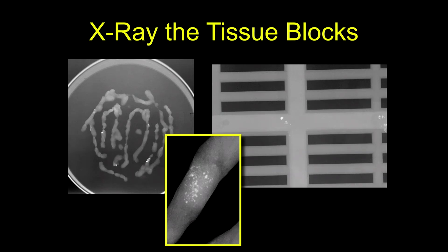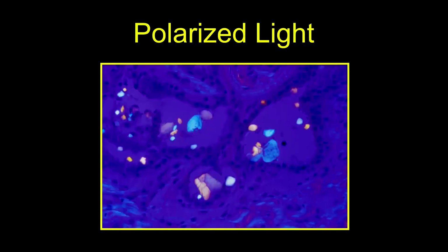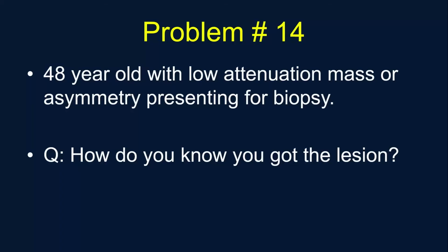Because the reality is your pathologists hardly look at any of the total amount of the tissue. They're just taking representative samples of tissue that they're making into slides. So there's a lot of other tissue that they have not actually even examined. So usually it means it's probably in the tissue block. They just need some help finding them. The other thing, if you think it might have been milk of calcium, tell them, okay, do the polarized light to look for those calcium oxalate crystals.